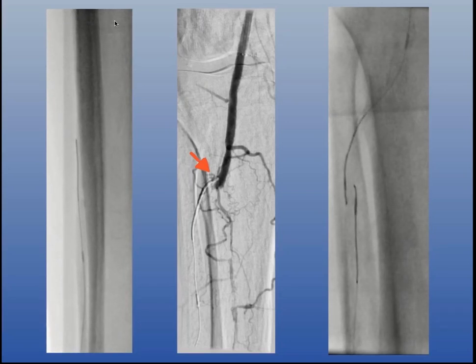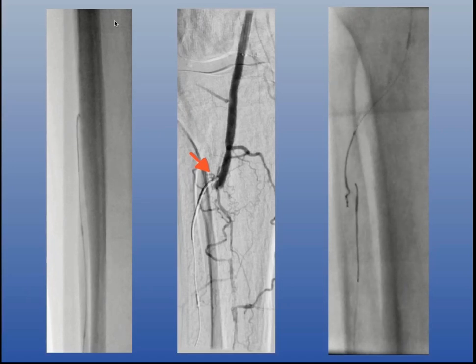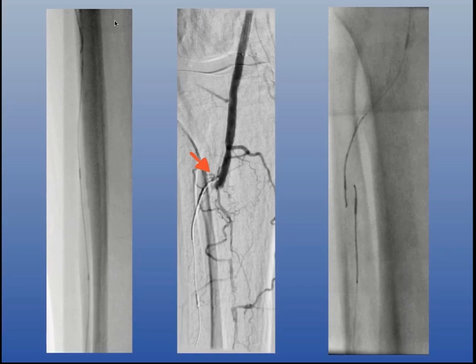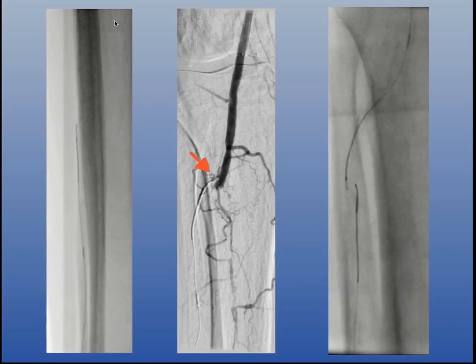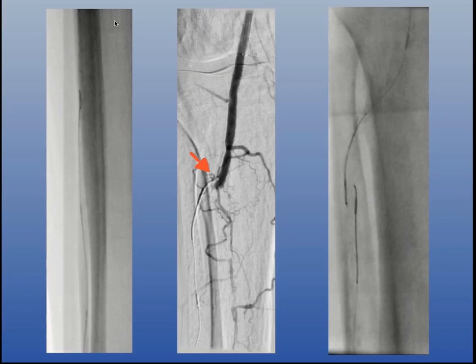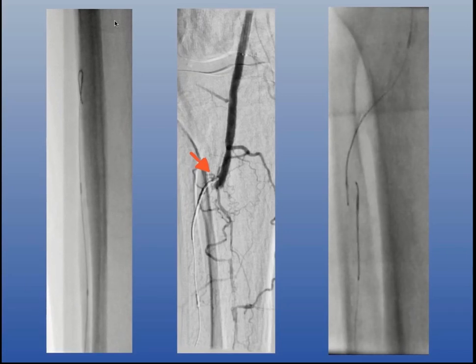anterior tibial artery. And then on the middle image, I got to that point and I thought, oh, this is great, I'm done. I'm so good at this. And then I realized I'm in a completely subintimal plane. And so you can see how a lot of times these recanalizations kind of fool you. You think, oh, this is great, I'm in a great spot, and then you end up someplace where you really don't want to be.